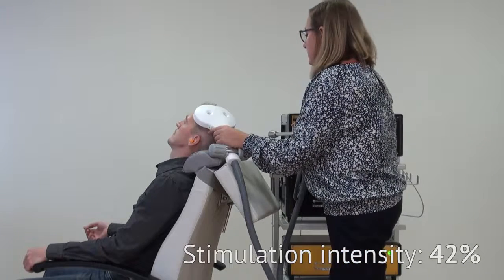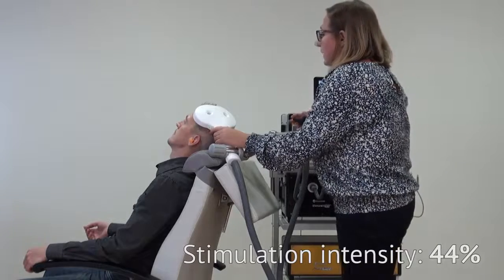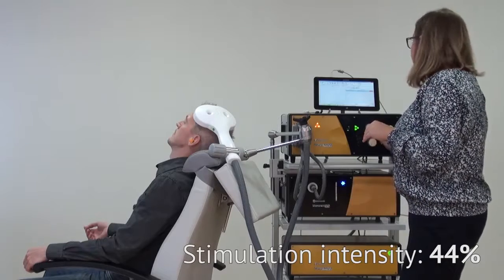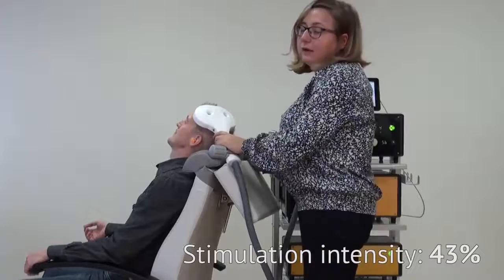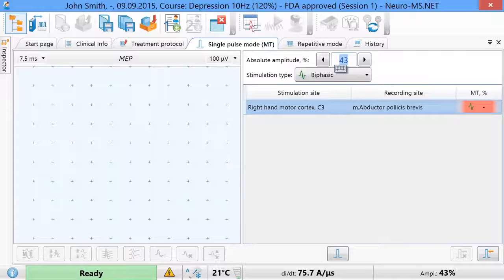and deliver stimulus until the muscle contraction is seen. After that, decrease the amplitude by 1% step. For this patient, the motor threshold is 43%. And now we fix the motor threshold.